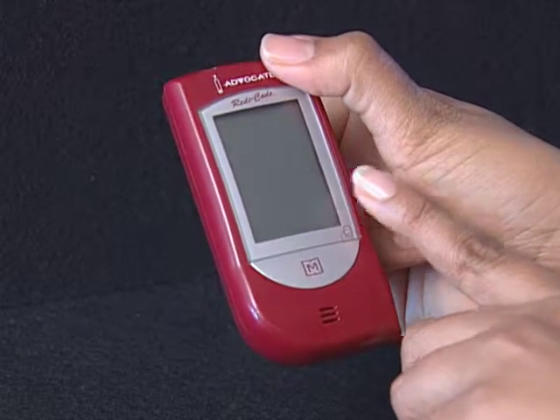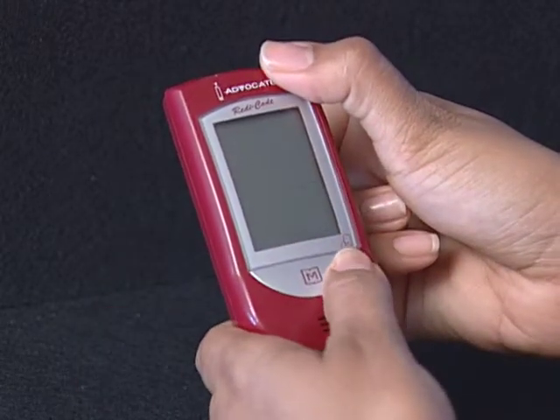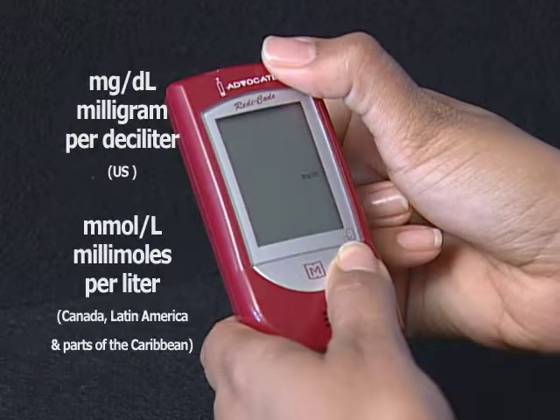Step 6: Select milligrams per deciliter (MG/DL) or millimoles per liter (MMOL/L). Milligrams per deciliter is standard in the United States.